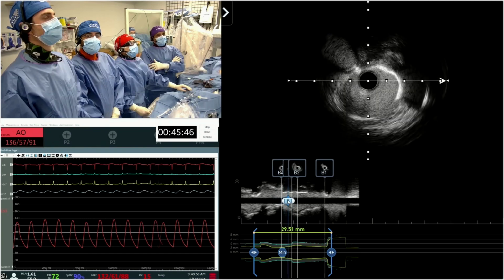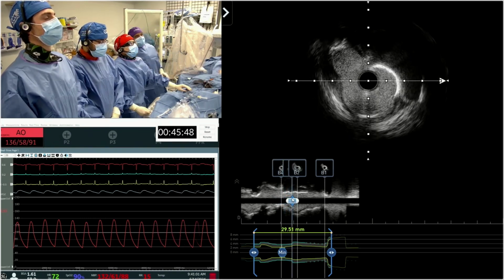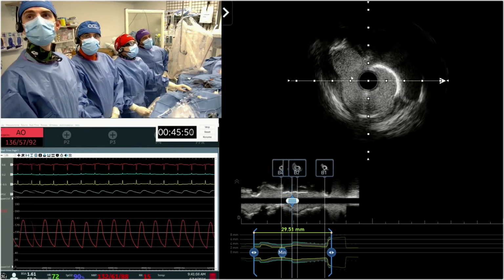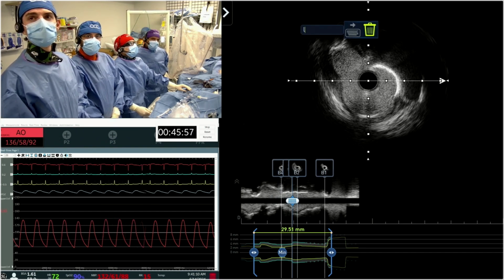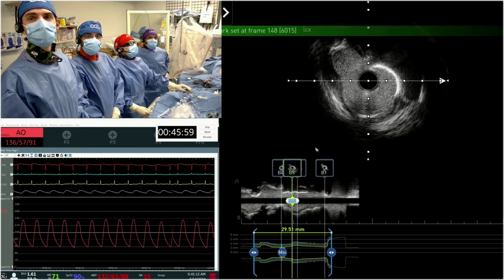Anyone else? Or am I the only one? But I mean, by the IVUS it looks okay. Look at that. Well, that's a side view, which is like half of the view. Yeah. Because on angiogram it looks no downside to looking at the ostium of the circumflex.